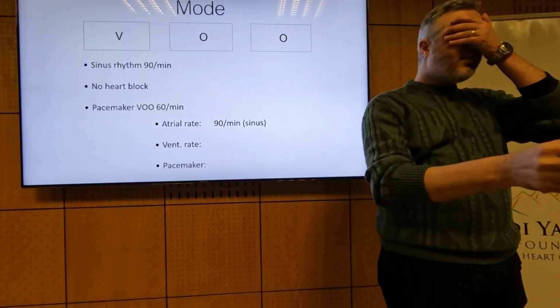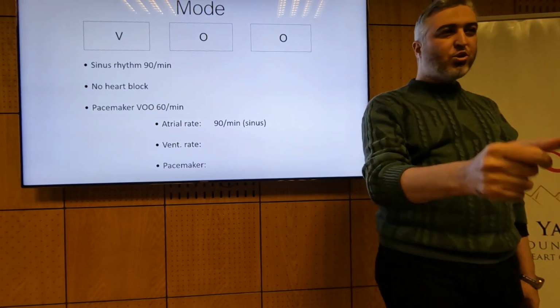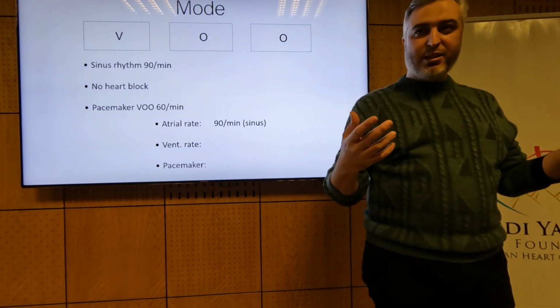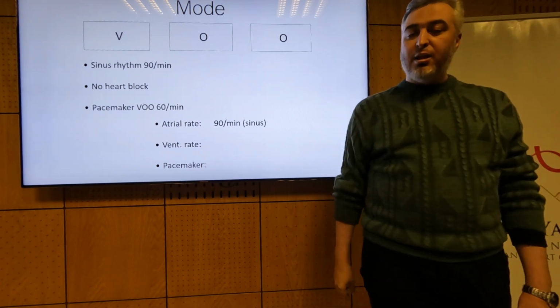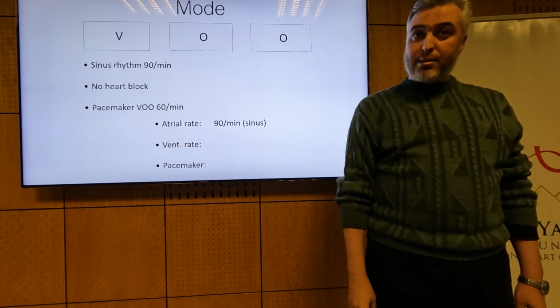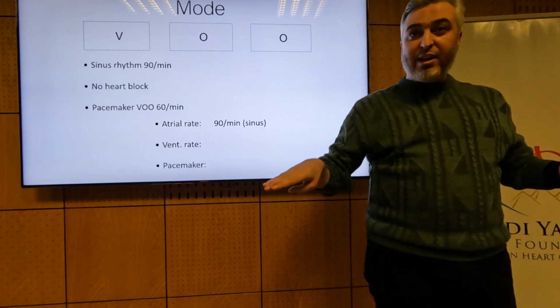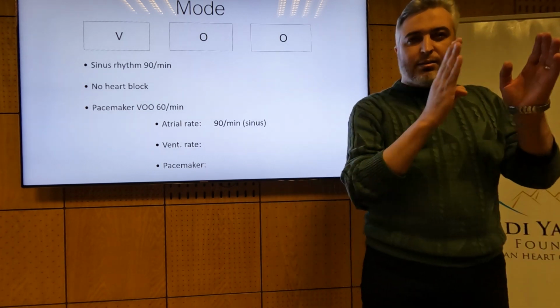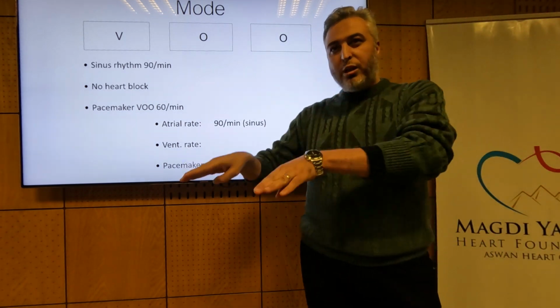You keep pacing the ventricle. So sometimes it lands in a refractory period and does nothing. Sometimes it lands outside a refractory period and then again paces. Then sometimes you pace on the T and then you get R on T. You get VF. You have caused your patient to die.